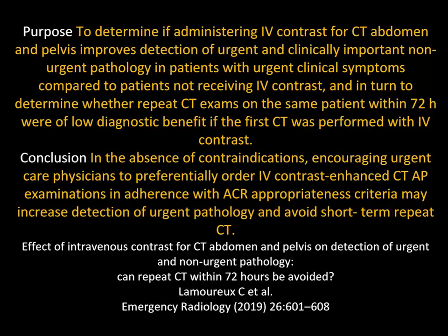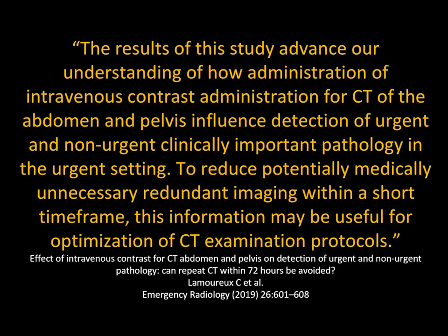This is part 3 of our talk on protocol optimization in CT, what you need to know. Now, I left off with this slide last time, and I wanted to go into it in more detail. This article by Lamoureux was very good. It made the point, should you give IV contrast routinely in the ER setting? I know you don't need it for stone protocols, but for abdominal pain, you often see clinicians now, no oral, no IV. Oh, you got to be kidding me. Well, this article made the point that you miss many things and you end up doing repeat studies.